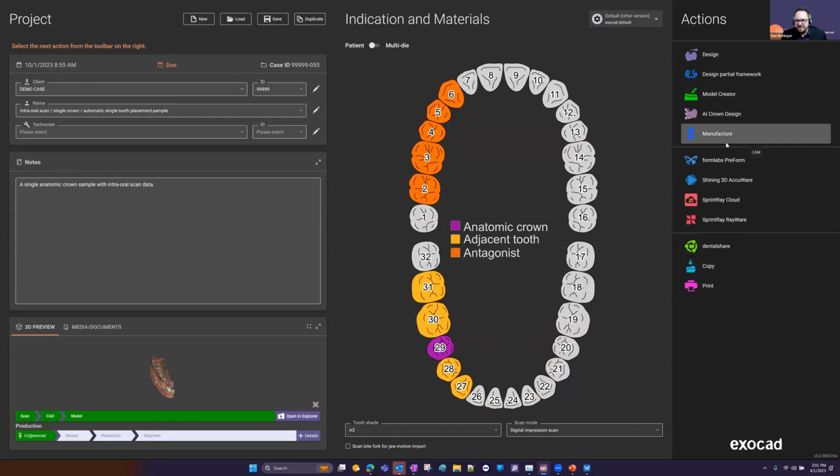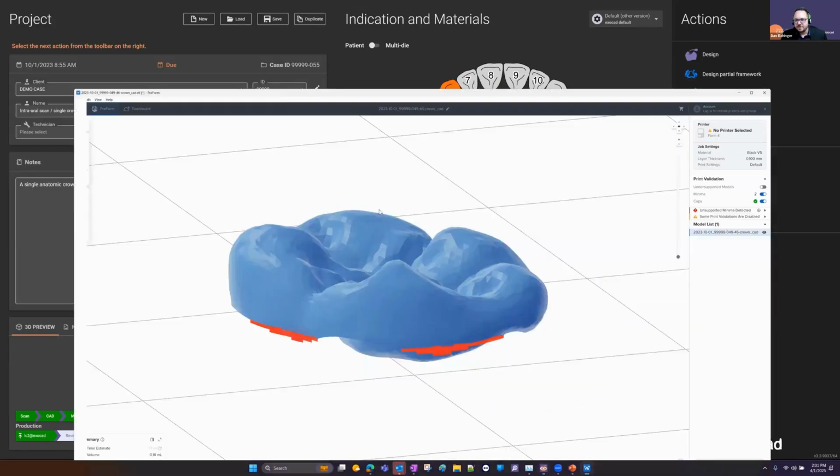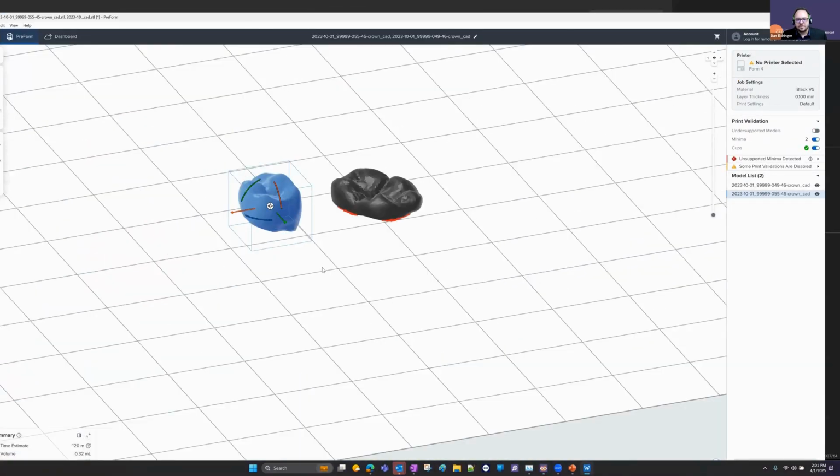Navigating, it's a lot of intuitive features that have been added, and it's really derived from all of our users. Basically, we look at feature requests very seriously with our company, and I totally respect and love that about our company and our development team. A lot of these features are derived from our customers.